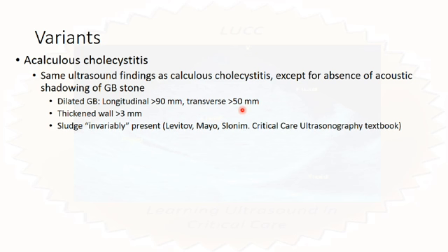And this is from a textbook of ultrasonography. So even when you do not have stones, it's invariable, according to one textbook, to have sludge. Now, the reason a sonographic Murphy sign may be absent, and this is often because the patient is very, very sick and is either comatose or sedated. Okay, but as I've said to you before, even in such instances, if you press, often patients wince.